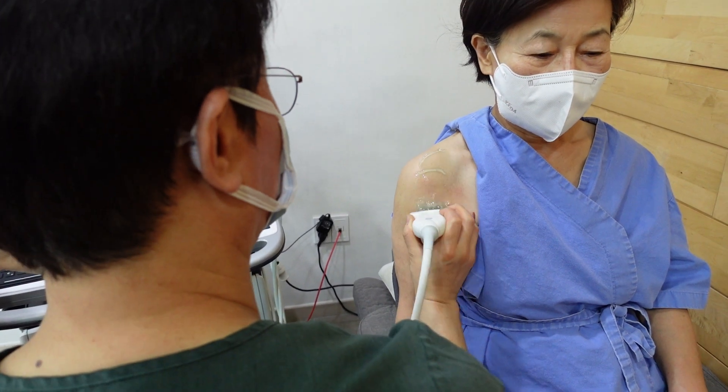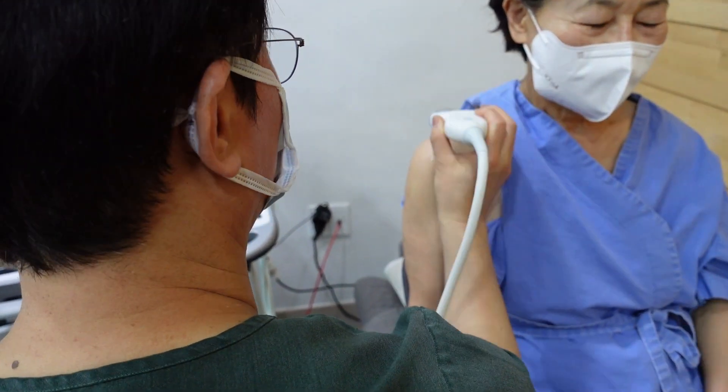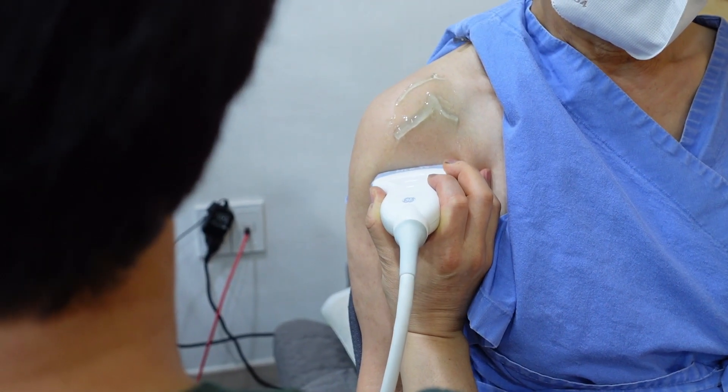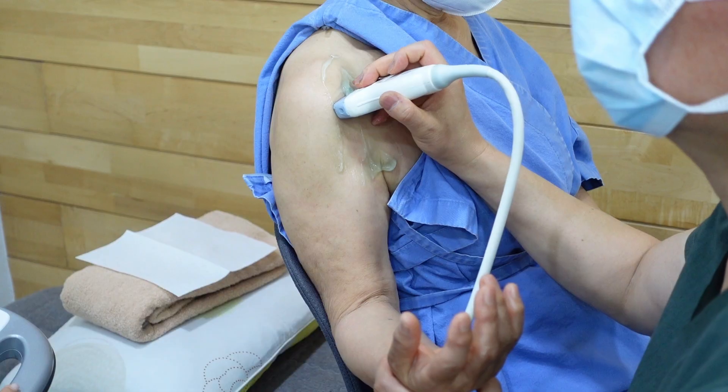Proper grip and orientation: grasp the ultrasound probe using your thumb and index finger, similar to how you would hold a pencil. This allows for better control and precision when moving the probe.